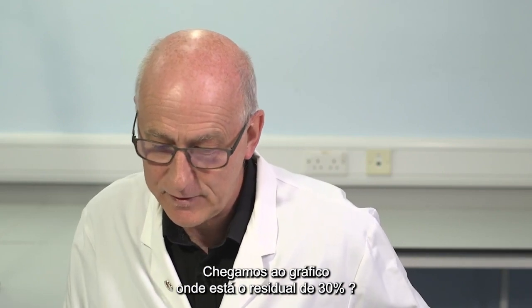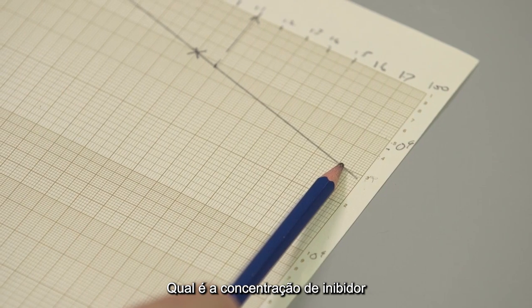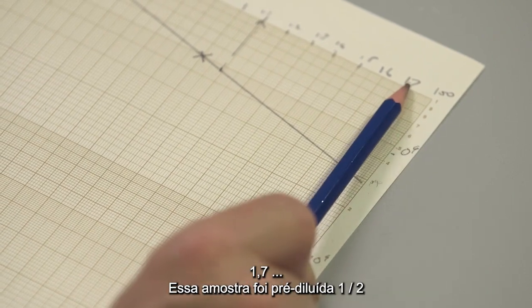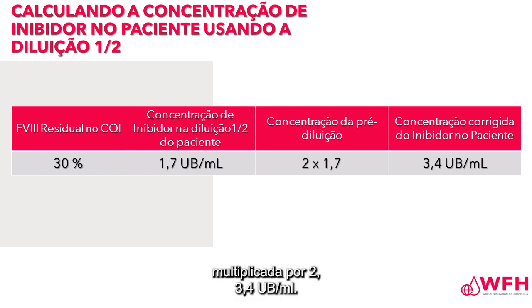Where is 30% residual? Here. What is the concentration of inhibitor that would be associated with 30% residual factor VIII? 1.7. That sample was pre-diluted 1 in 2. So the concentration in the patient, 1.7 multiplied by 2, 3.4 Bethesda units per mil.